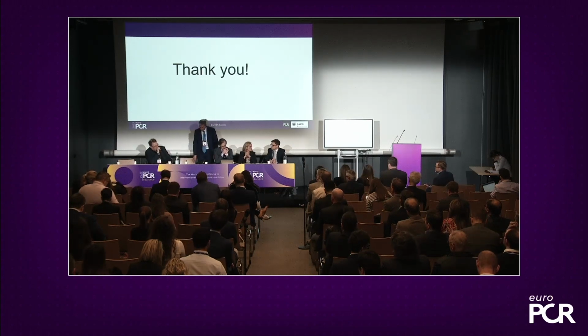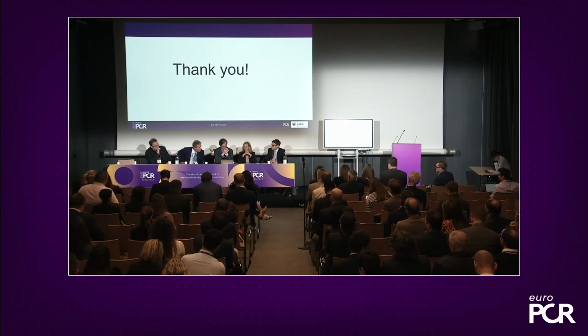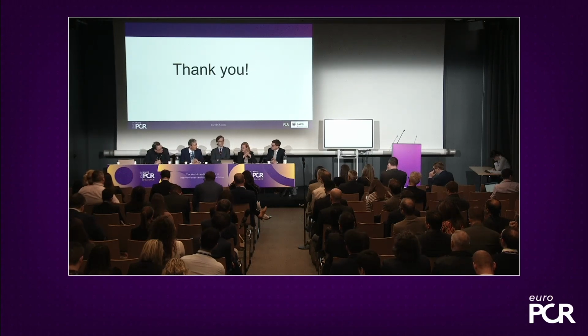So thank you very much, Sergio. Very impressive, and that's the next level. So that's not only having the ICE probe in the atrium, that's orienting your ICE probe depending on what you want to see. And for this, you need an additional sheath. So you have demonstrated this very nicely. I think very challenging. Maybe one question for Felix.